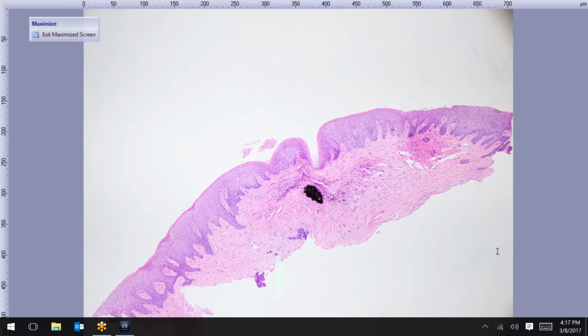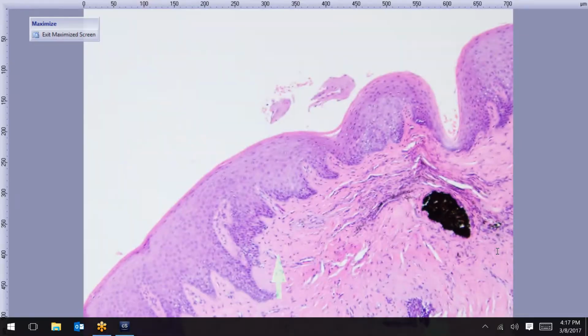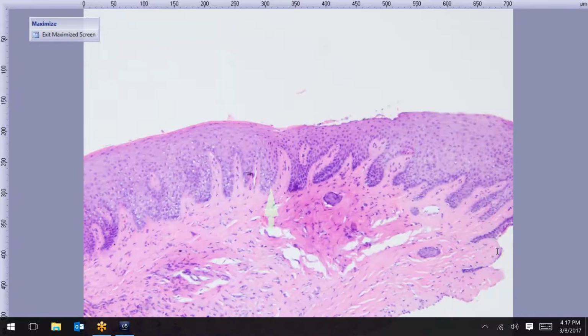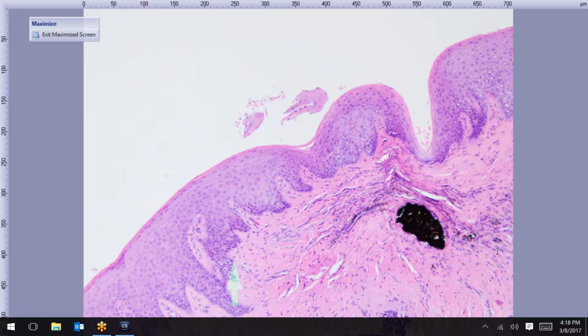Oh yeah, that is mucosal. Yep, so it's not keratinized really, and you don't really have a granular layer. So it's non-keratinizing, no real granular layer, and then really that's the main thing. We're focused here. Very welcome.